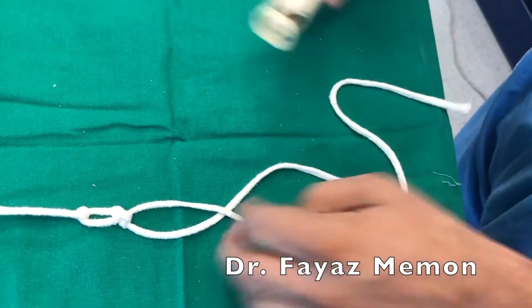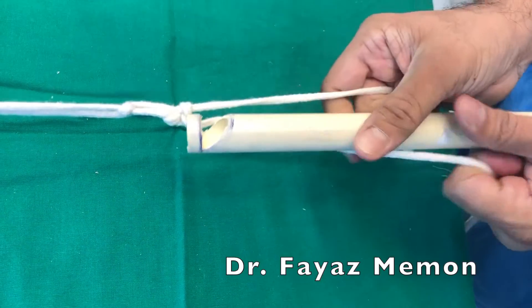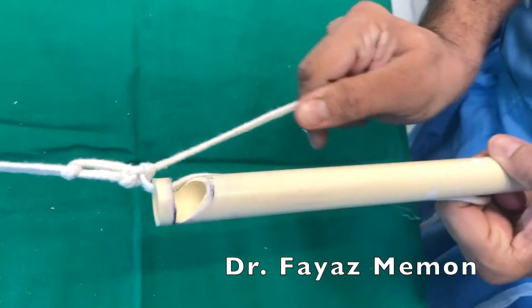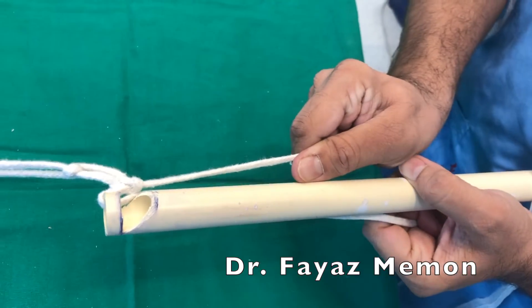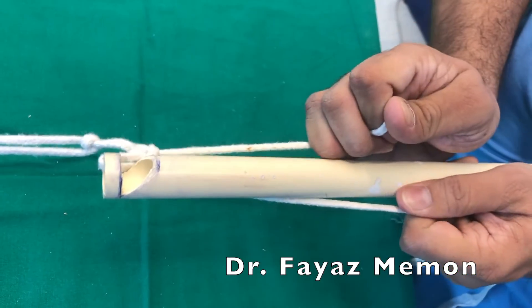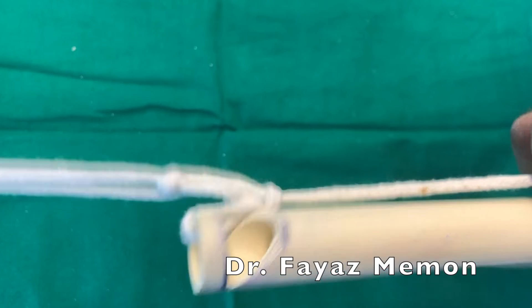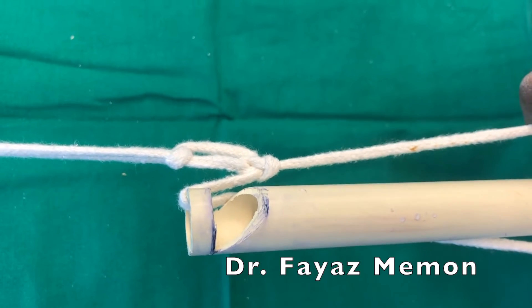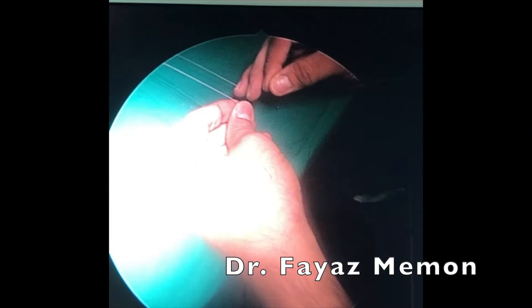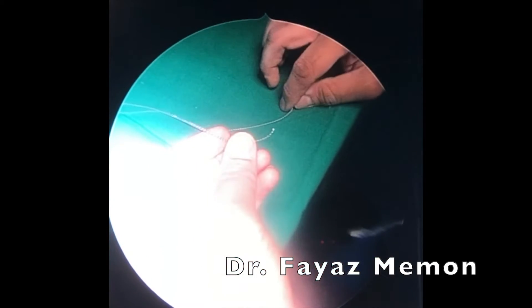So you can see the first two are the same and this third one comes opposite. When this secures to the previous knots and you push with your knot pusher it tightens. The knot tightens over here and then it is so secure that it cannot back out and your construct is strong. Once you reach here you should pass the point — go down, push the knot pusher, and pull the other limb like this. Once you reach there you just pass point and cross the knot so that the two limbs are pulling each other in opposite directions. Now I am going to show you the arthroscopic view of how we take a sliding knot as well as the stationary knot over it in one go.